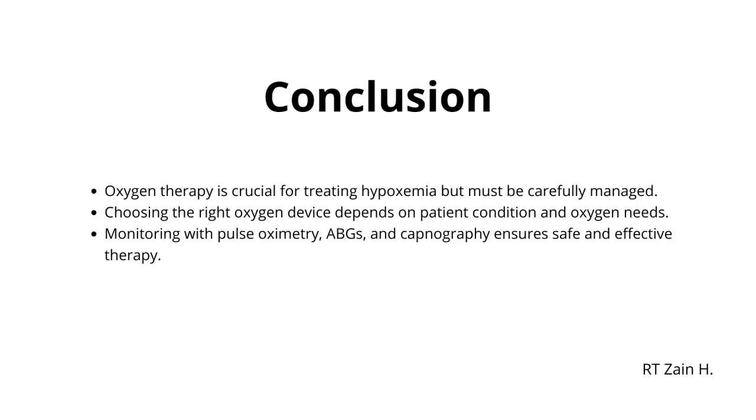Oxygen therapy is crucial for treating hypoxemia, but must be carefully managed. Choosing the right oxygen device depends on patient condition and oxygen needs. Monitoring with pulse oximetry, ABGs, and capnography ensures safe and effective therapy.